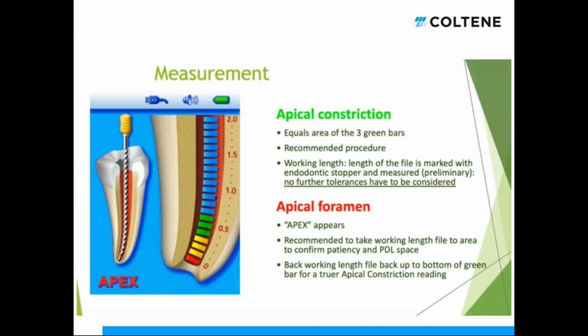And that's a good point because if we could have this customized to be able to completely read the anatomy of each tooth, that would be nice. But the apical constriction is the part that varies as we age, right? Because that theoretical area gets smaller as we age. So it's just kind of a guesstimate. But no, it's always three and three.